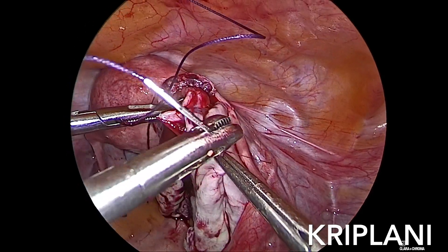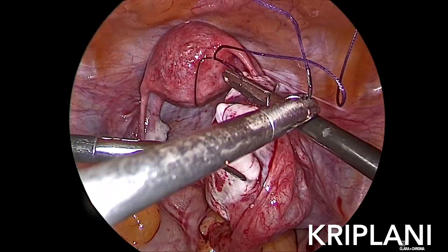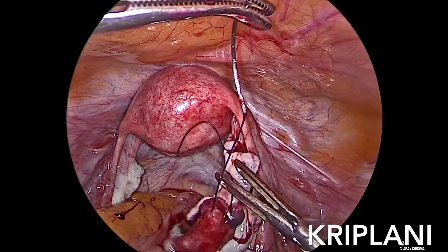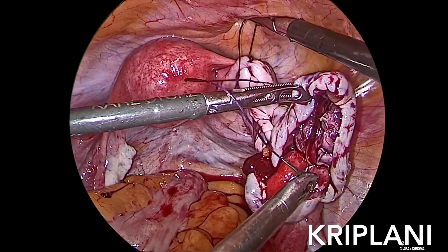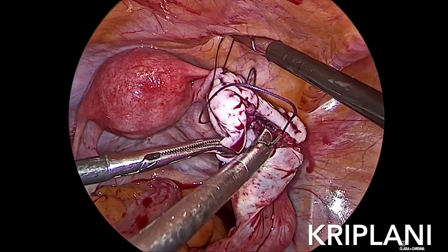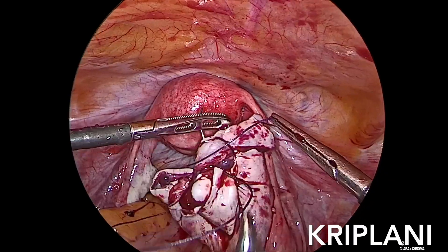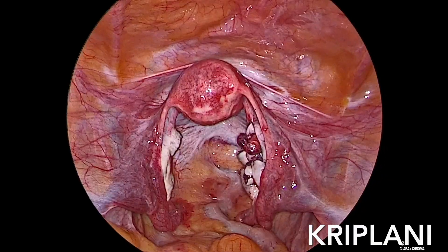And with 2-0 vicryl, the ovary is reconstructed. One can avoid using any cautery on the bleeding points and the ovary can be normalized with proper suturing. And this is the end view.